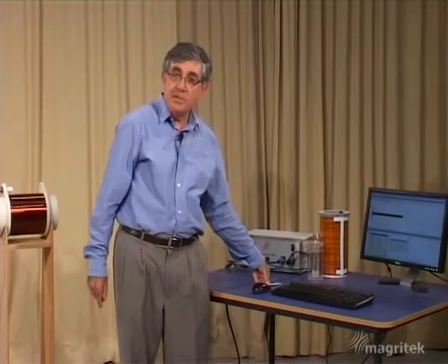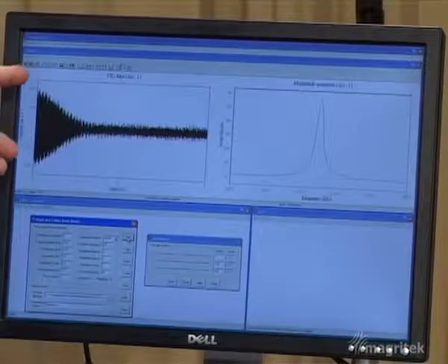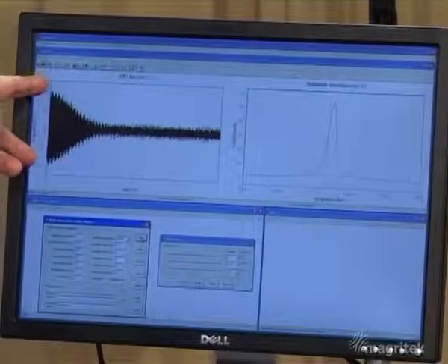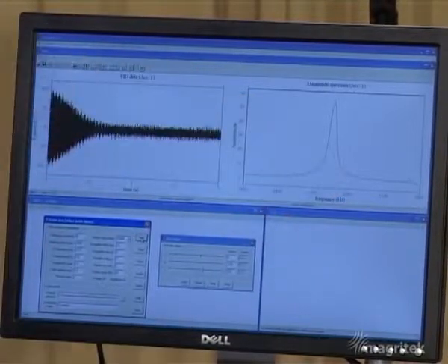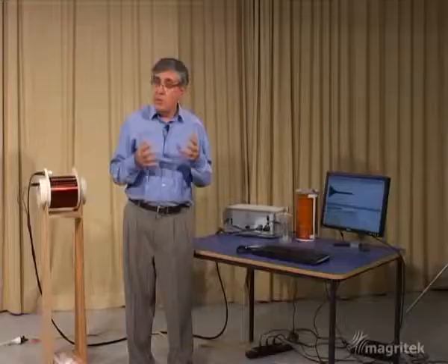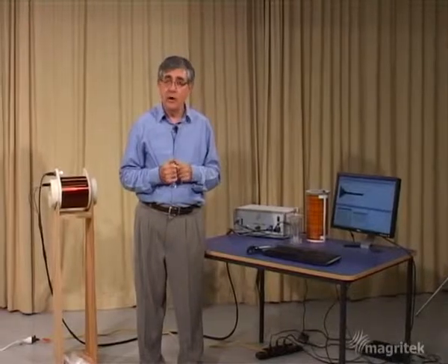I've got the spanner back on the table now. Let's repeat the experiment to see if we return to the initial condition. There's the signal, and you can see the same rate of decay that we had when we started, returning to a much narrower spectrum. So can we do a better job? Can we improve on the homogeneity that we've got at the moment?